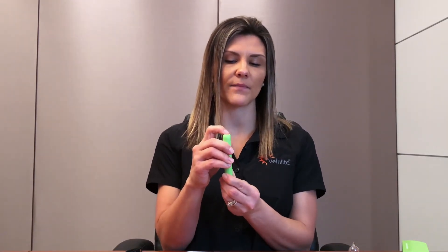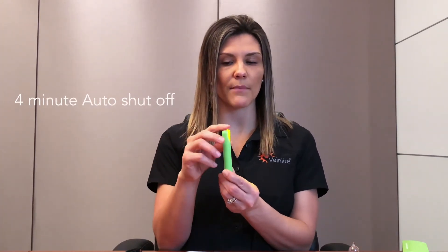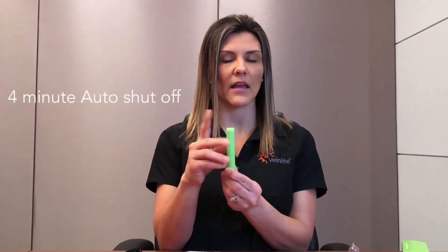To turn off the Veinlight Neo, cycle through all three colors until it turns off, or press and hold the top button and it will turn off. To use the Veinlight Neo, you will need to protect the Neo with a disposable plastic cover.